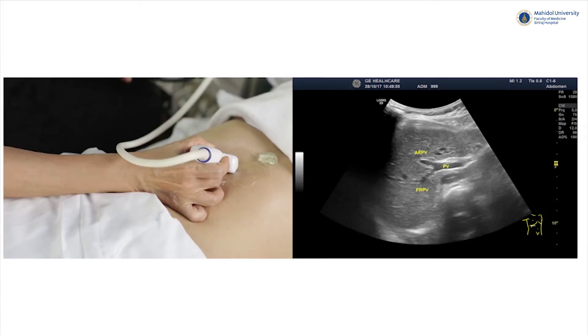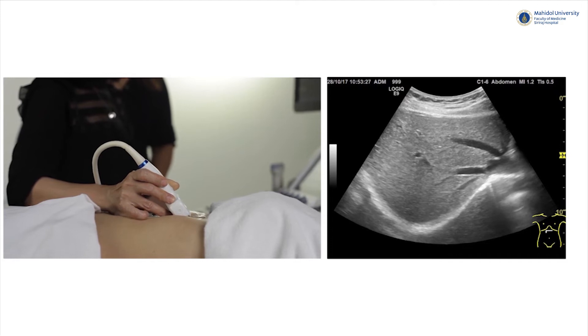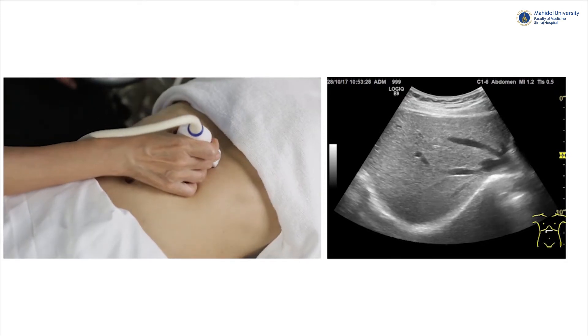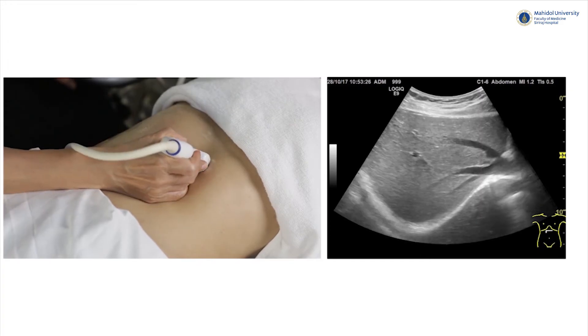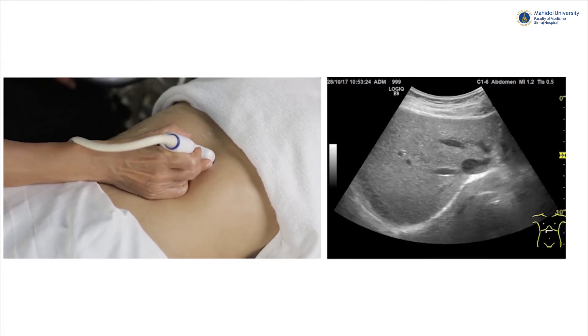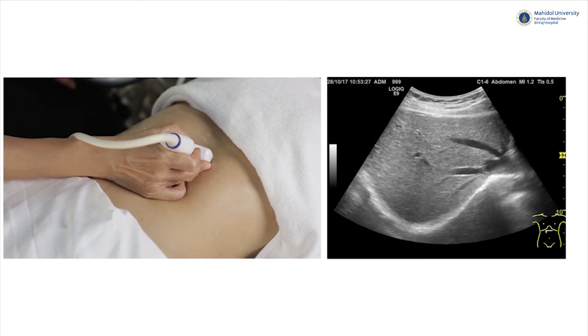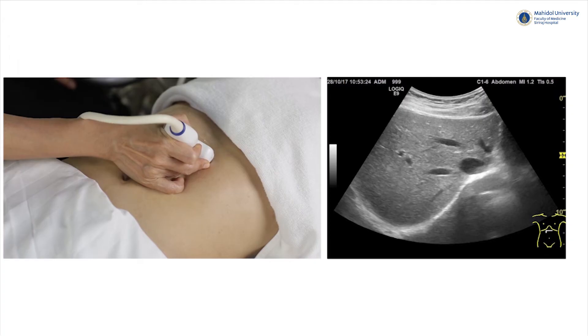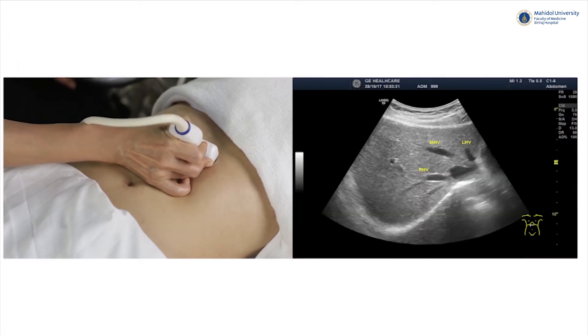The right portal vein further branches into anterior and posterior sections. There are three hepatic veins directing towards the IVC, which is best seen during the subcostal scan position. The differences between hepatic and portal veins are that the hepatic vein has no wall thickness and the direction is different. These are the left hepatic vein, middle hepatic vein, and the right hepatic vein, respectively.